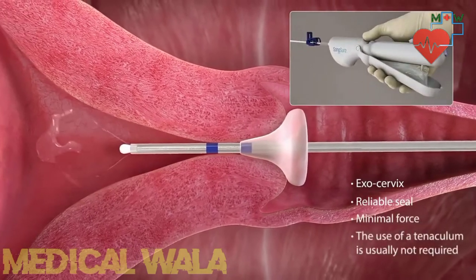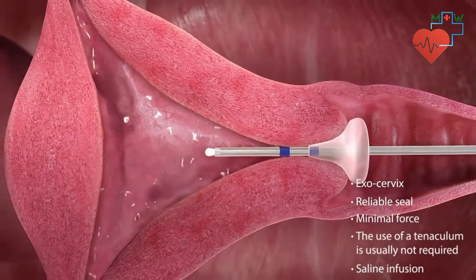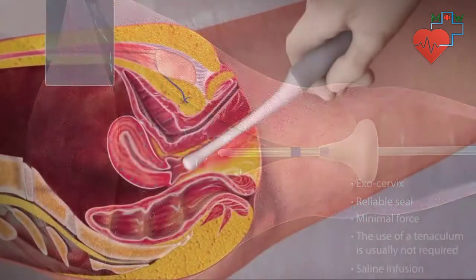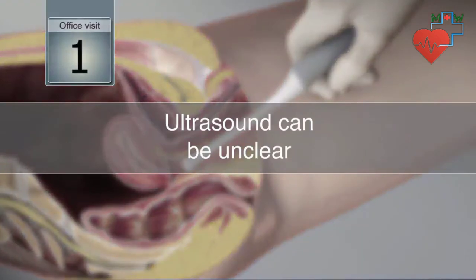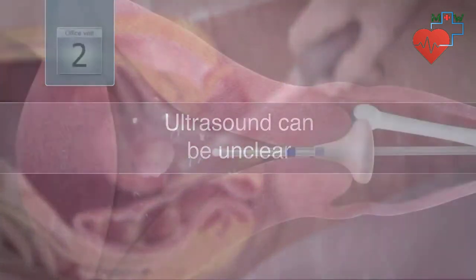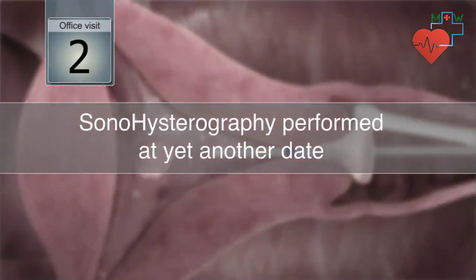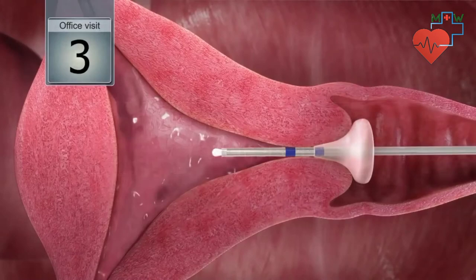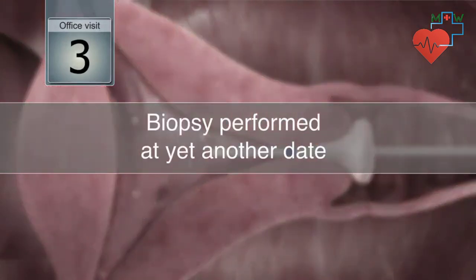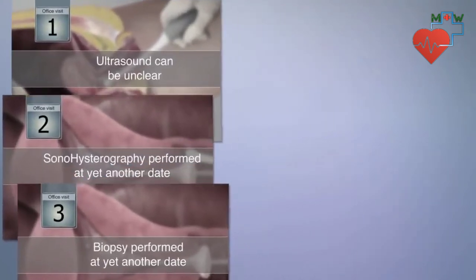This allows the physician to infuse saline and extend the uterine cavity for clear visualization and accurate diagnosis. When abnormal uterine bleeding is present, the typical first step towards diagnosis is an ultrasound. When the results are unclear, or if a lesion is present, a separate procedure or saline infusion sonohysterography must be performed at a later date. Finally, if diagnostics show an abnormality, then a biopsy must be performed at yet another office visit or via secondary uterine access.